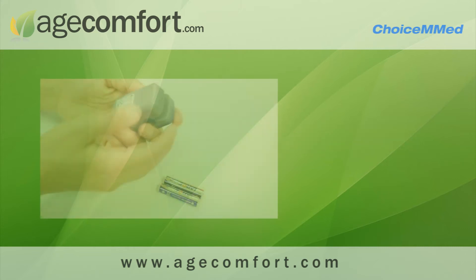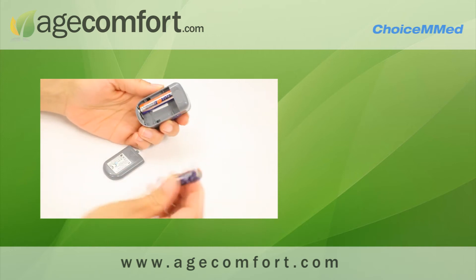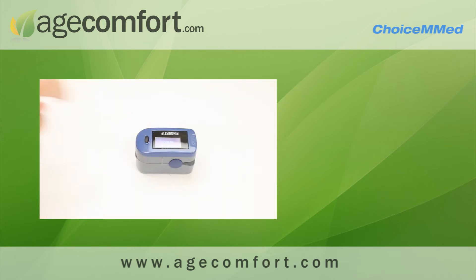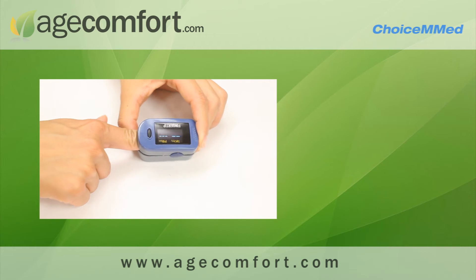To begin with, remove the back cover of the pulse oximeter and insert the two provided AAA batteries. Press the power key to trigger the pulse oximeter and then insert your finger to start your reading.